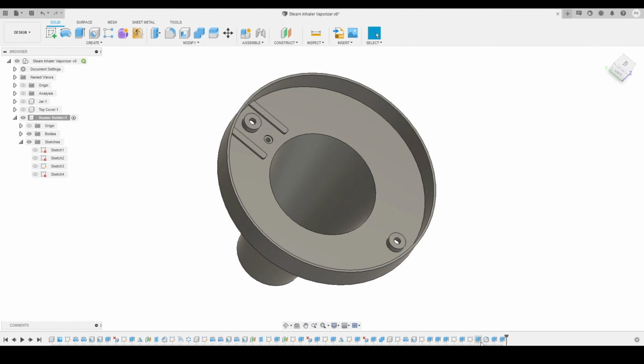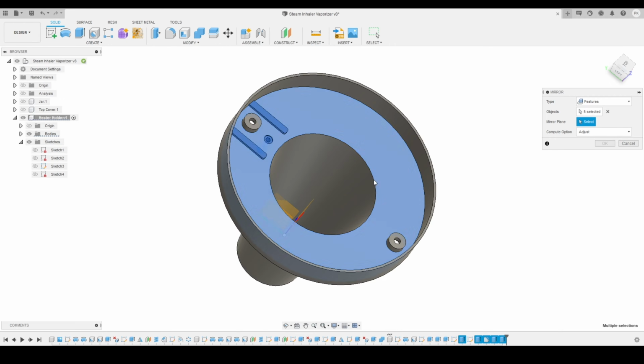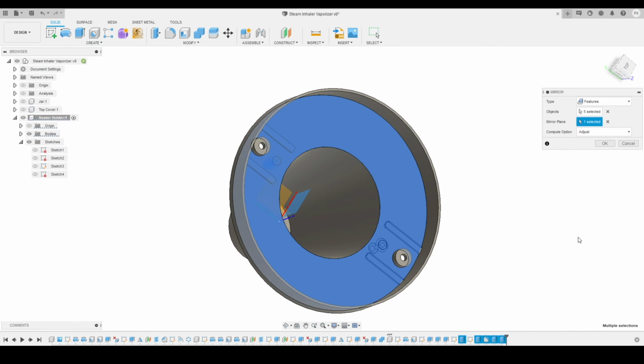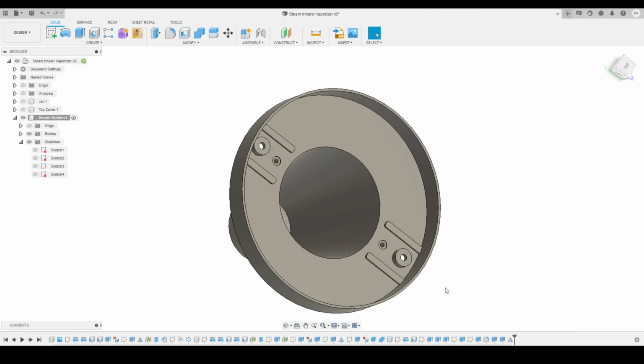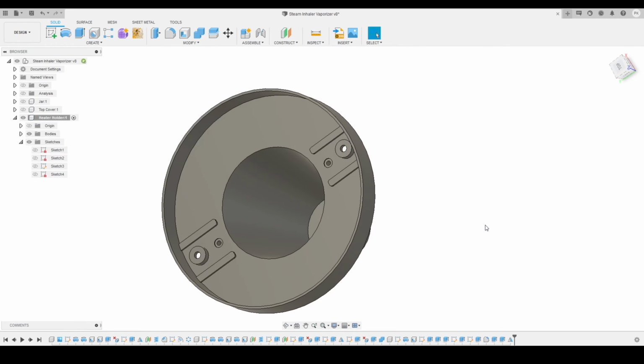Here you can see. And now I will go back to our profiles. I will select all these 5 features and go on to create panel, then activate the mirror tool, then we'll select the mirror plane, and this is my mirror plane. So all the 4 features are getting mirrored on the other side also. So here you can see these are the results we had created on both the sides.